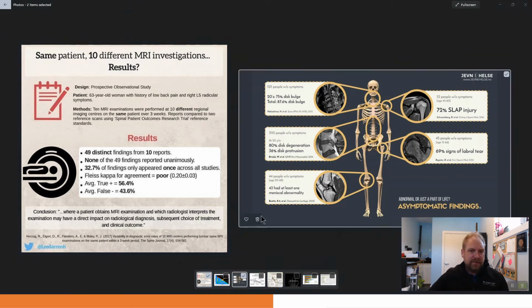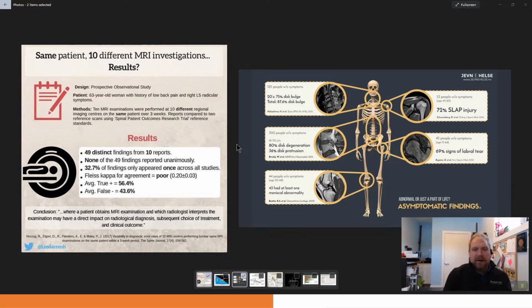Well, hey there, Dr. Andrew Gorecki, and in this video we're going to talk about what your MRI or X-ray really means as it relates to hip pain and diagnosing hip conditions. The quick answer is it doesn't mean as much as you think it does.